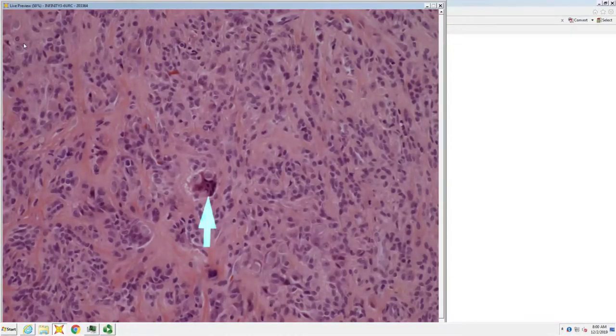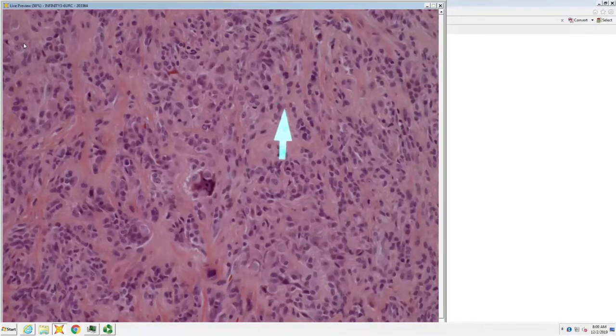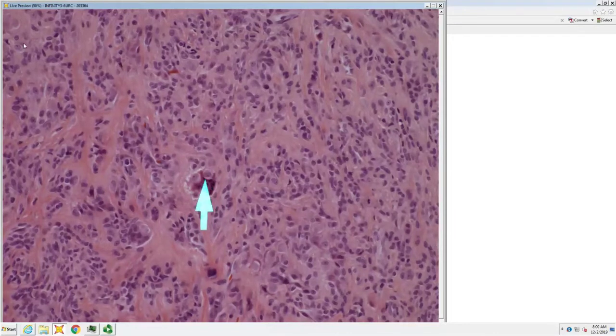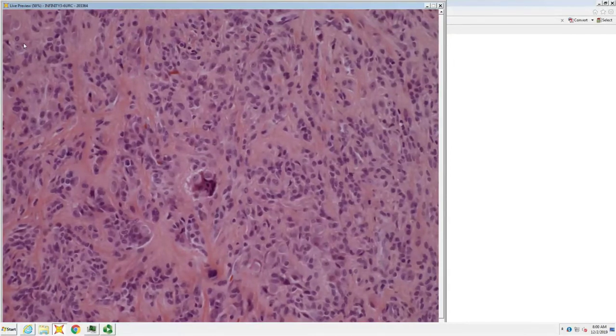It's a nodule. It has red, ropey to thick collagen. It has, just as in fibroma of tendon sheath, the plump, uniform, round to oval fibroblasts, and the scalloped border, like an amoeba, grabbing onto things, of an osteoclast-like giant cell.